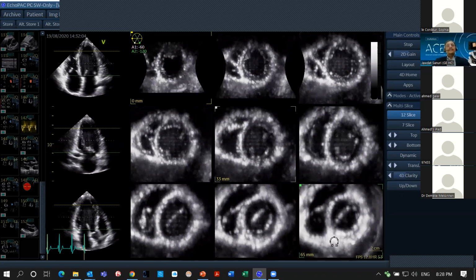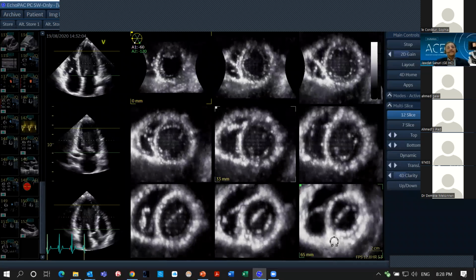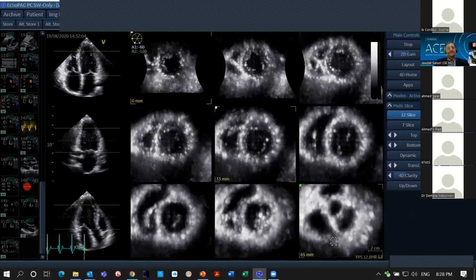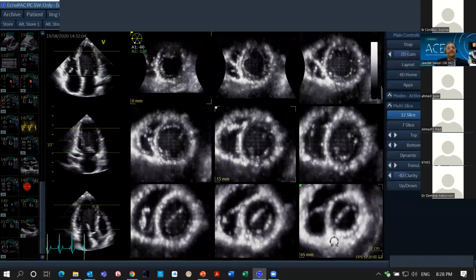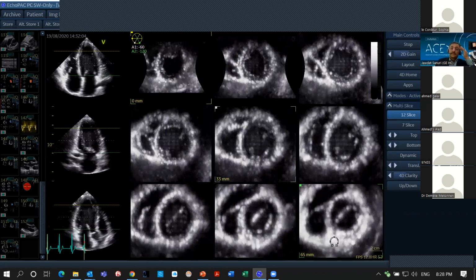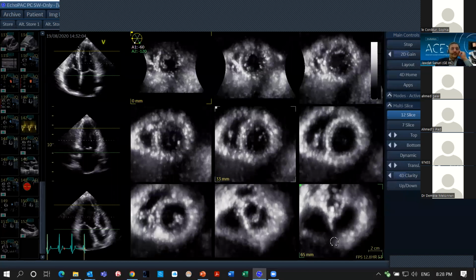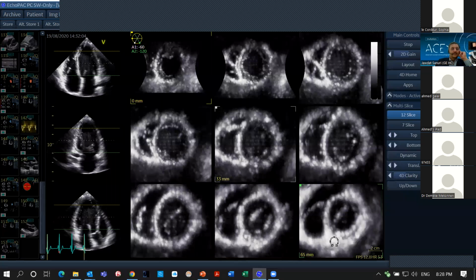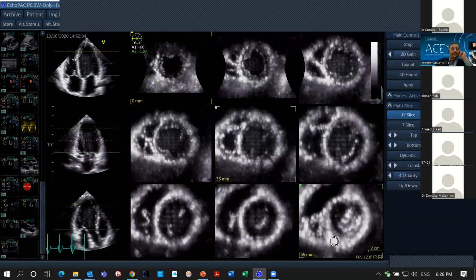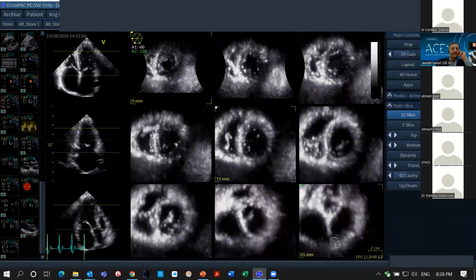I have a problem with the assessment of the mitral valve, mitral ring area. Sometimes we need to assess mitral regurgitation by the volumetric method, how much the volume of regurgitation. So I'm using the 3D annulus area. Either I'm using MVQ, the mitral valve automated assessment, which will give you the mitral valve area. But usually with this method, the mitral ring area will be an odd number. You get numbers like 13, 14.